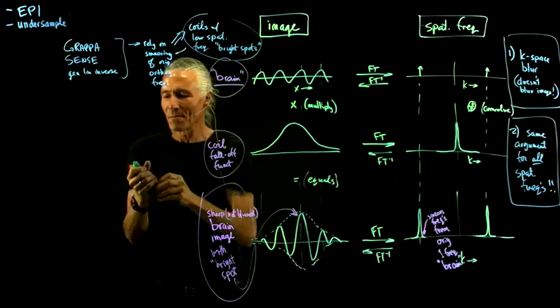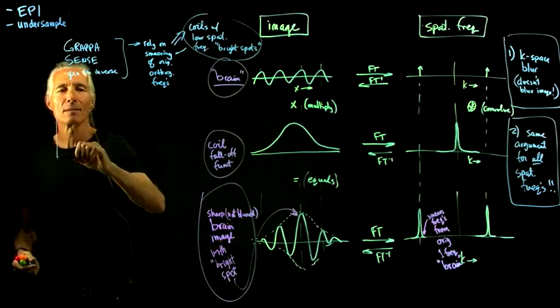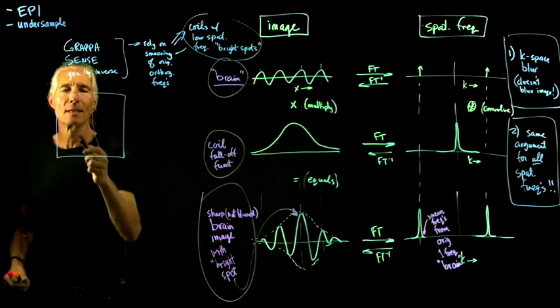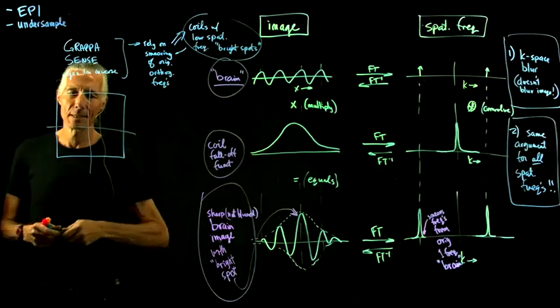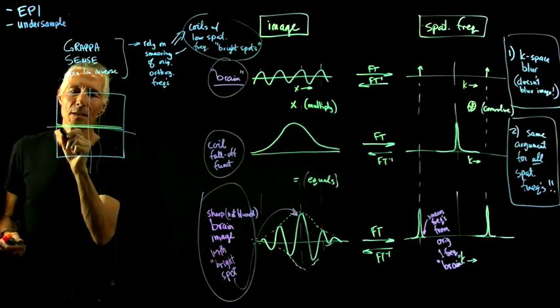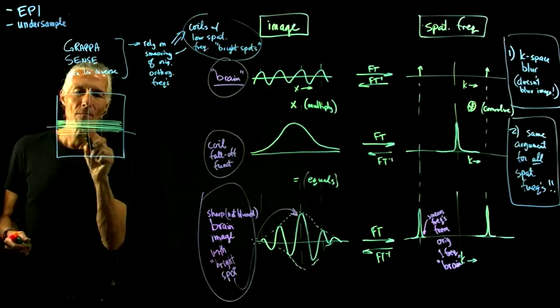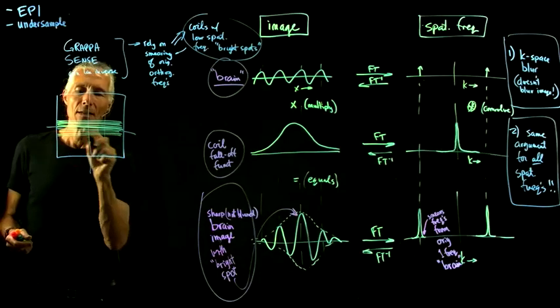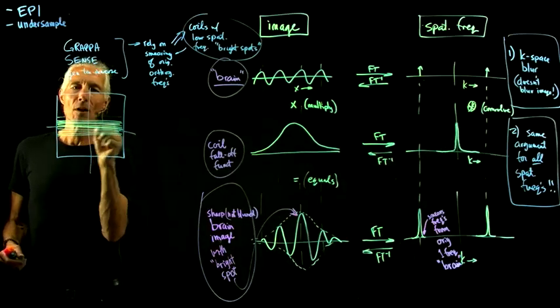How do you do this? We'll just give the example for GRAPPA. How you do it for GRAPPA is you first record all the lines of K-space. Usually what they do is record all the lines right in the middle of K-space, because that's where the signal is the best. So for the first scan, if you're doing GRAPPA, record all the lines of K-space in the middle.